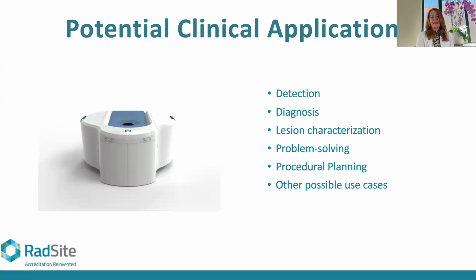I had a really interesting case of a patient who had several episodes of implant placement and revision with different doctors. We work really closely with some amazing plastic surgeons, and they have very specific questions. They want to be able to see, why does this implant look like this? What's going on with the position or the shape change or the scar tissue formation around an implant? They have very specific questions.